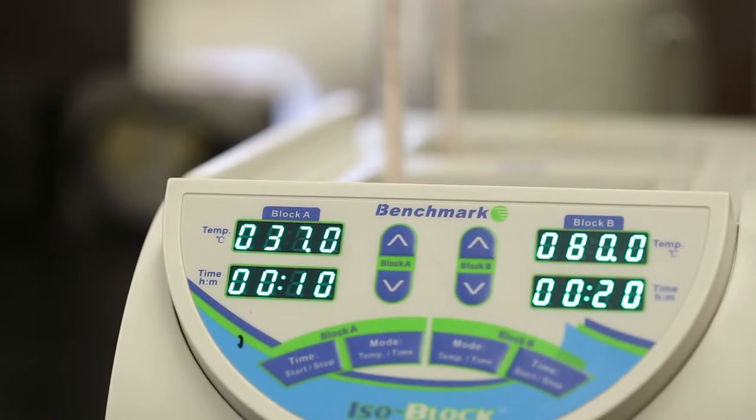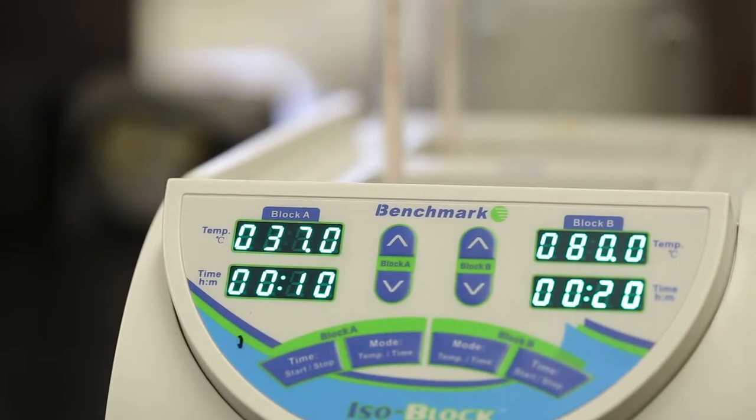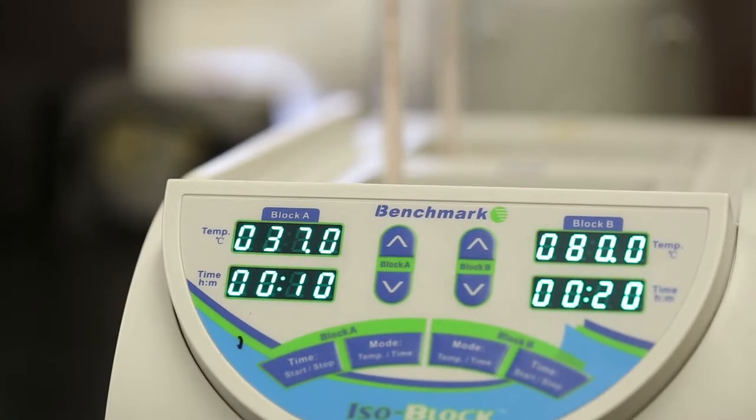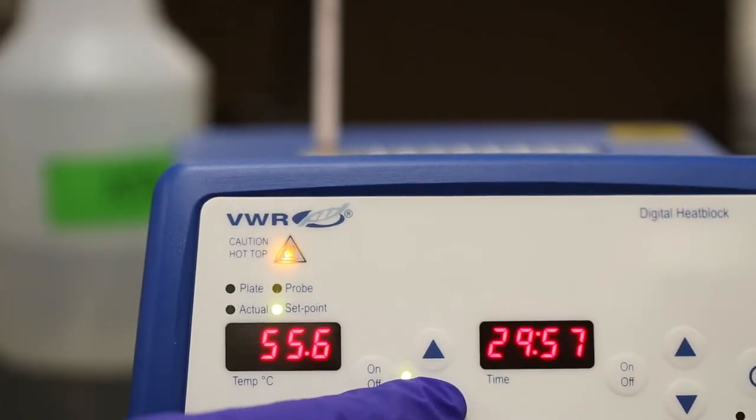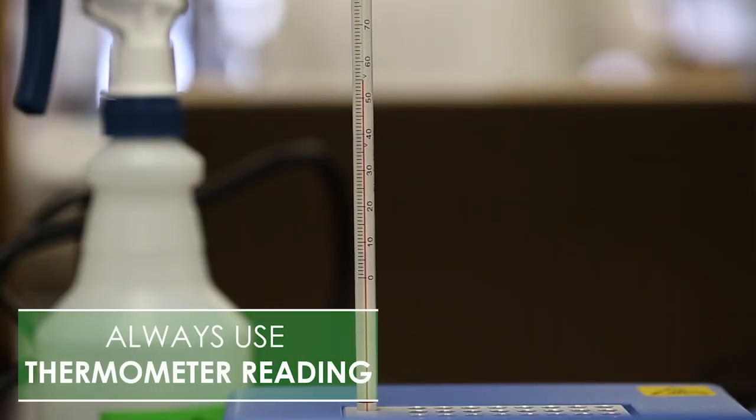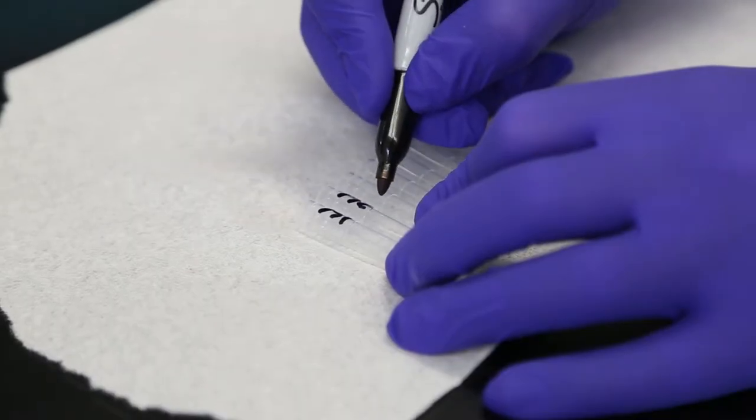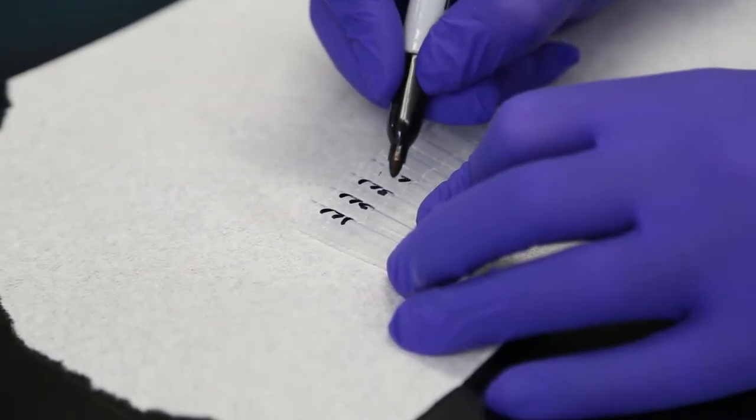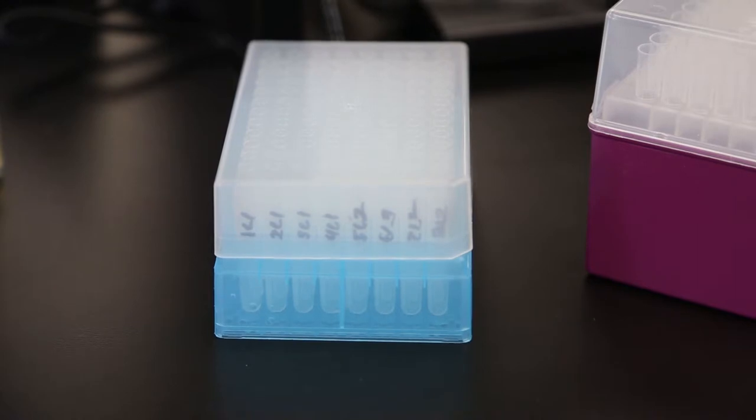Check the three heaters. They should read 37 degrees, 80 degrees, and 56 degrees Celsius respectively. If they do not, they may still be heating. If they appear to be done heating, indicated by a beep from the unit, check the thermometer in each block. If they do not read the appropriate temperature, adjust the heating block to within two degrees. Always go by the thermometer reading. Once the thermometer reaches the correct temperature, the heater will hold there even if the digital display varies. Take a strip of the 1.2 milliliter cluster tubes and mark them to correspond to your labeled samples.